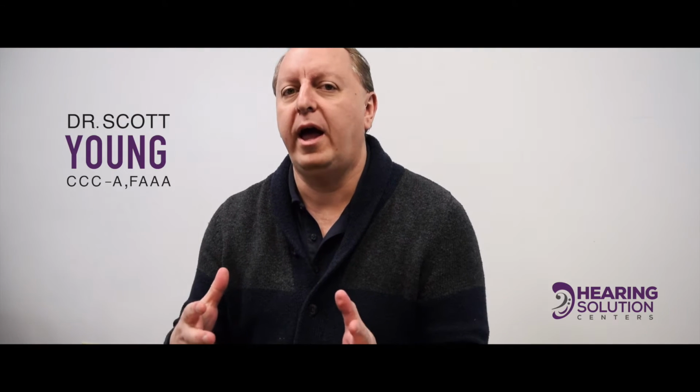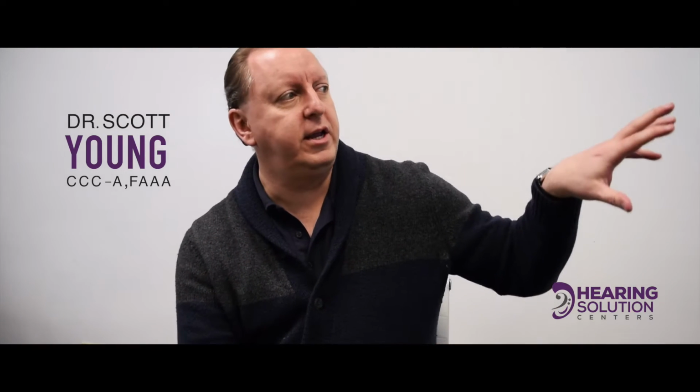If you have a problem where you can hear these people over here who are a lot farther than the person in front of you, that is a hearing aid setting problem. Most of the hearing aids have as many as 115 separate adjustments. And if you have that problem, your hearing aid dispenser or your audiologist, and hopefully you're seeing an audiologist, is going to be able to take care of that more effectively. So it's time to go back for an adjustment.